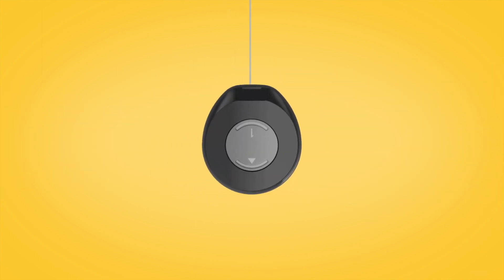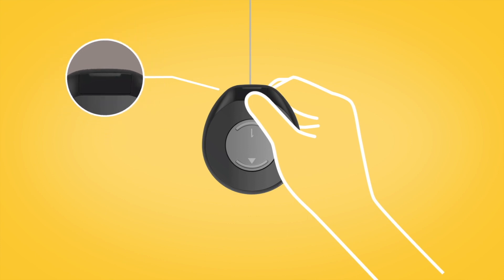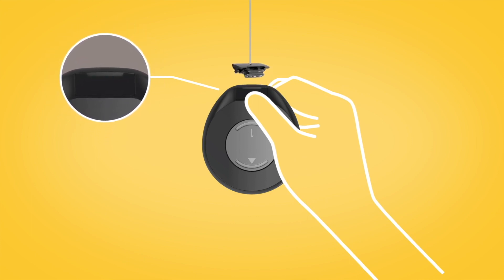To remove a safety line from your sound processor, place your thumbnail in the slot at the base and lift it from the socket.